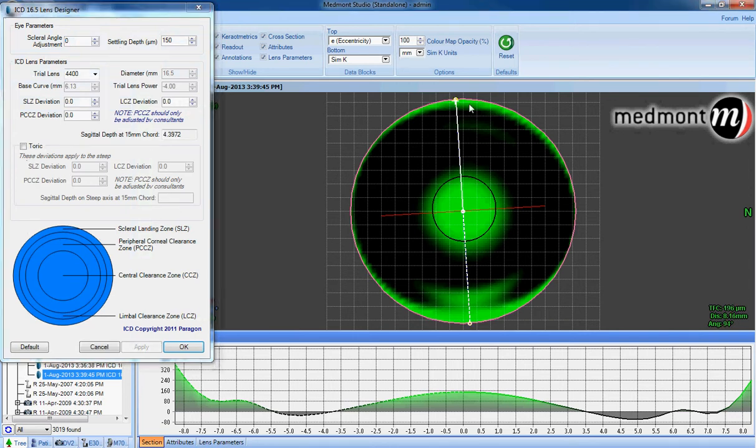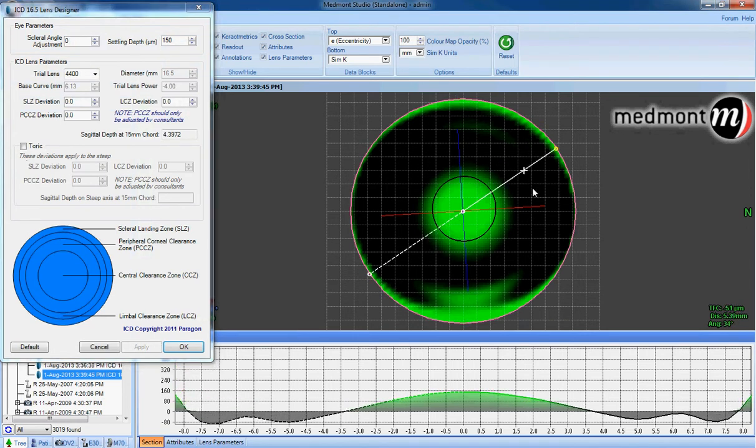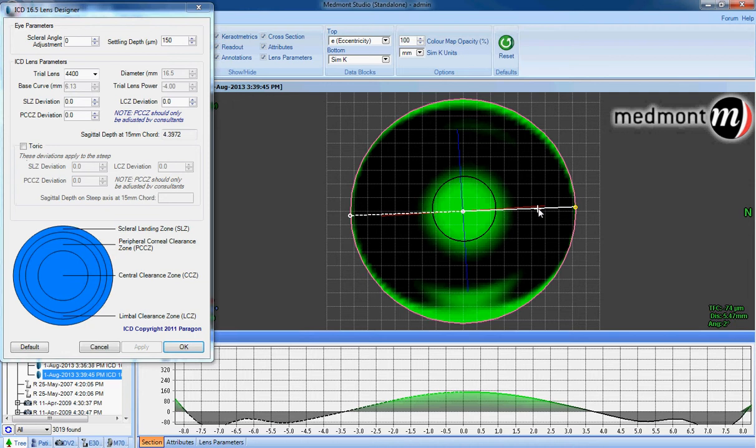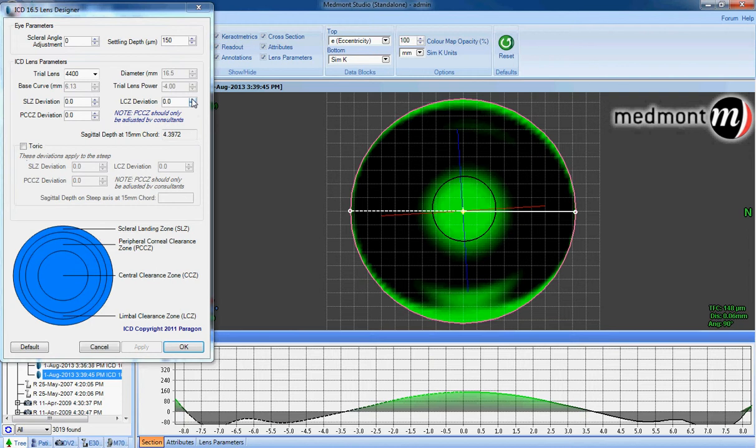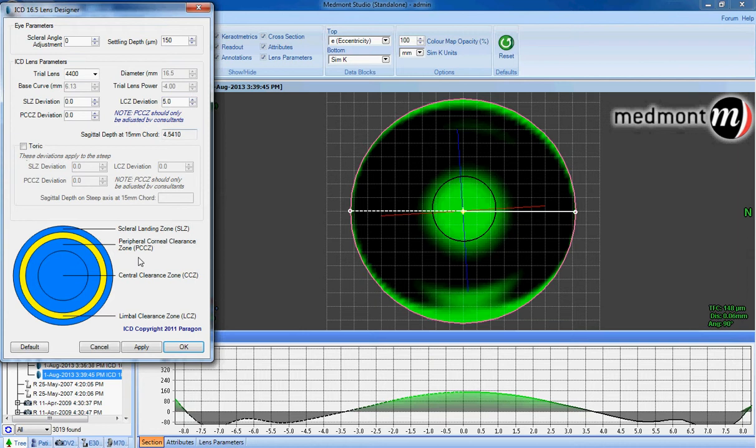Let's adjust the limbal clearance zone so we can model how that change might positively affect the fit of our lens. The typical adjustment is a limbal clearance zone plus 5. Let's create five steps of change and then apply.